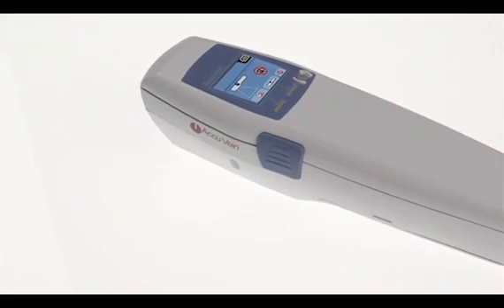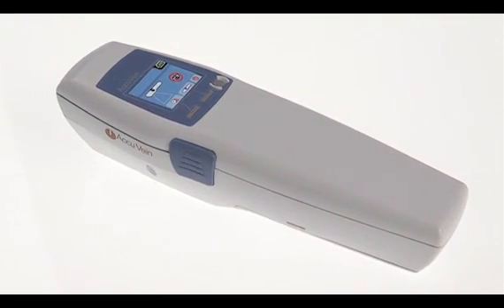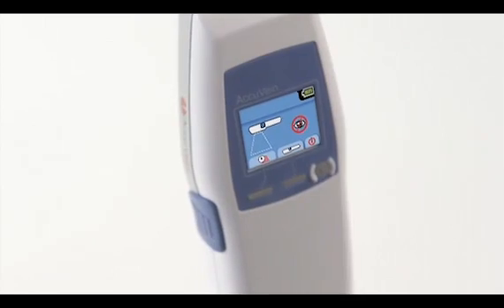Hi, my name is Heather and I'm a registered nurse. I'm here to show you the AccuVein AV400, a vein illuminator that projects a patient's vasculature on the skin surface.